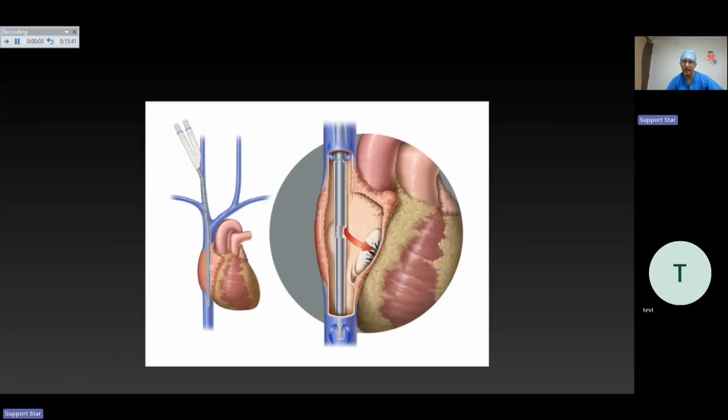So this is another technique. It's a double lumen cannula, which provides VV ECMO for neonates. But the challenge is that when you return your flow, it has to be directed towards the tricuspid valve. Securing the cannula in this position is extremely difficult. You have to do it under transthoracic echo guidance or fluoroscopic guidance. If the position is not good, there can be a lot of recirculation.